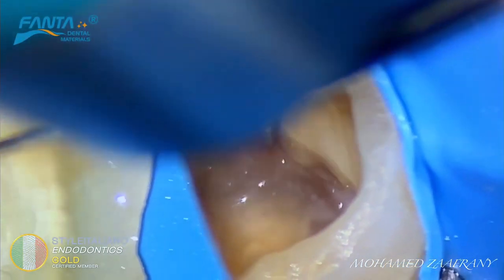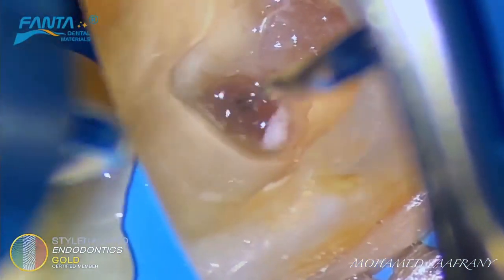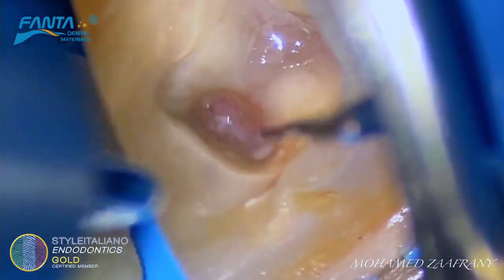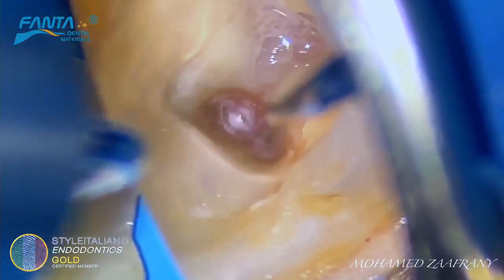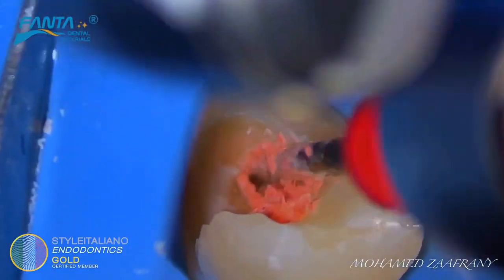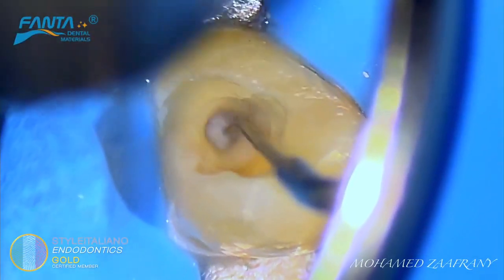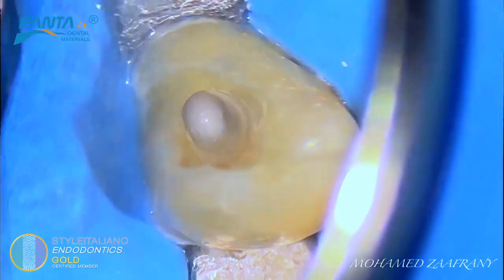The device is really effective in activating sodium hypochlorite, EDTA, and also in cleaning smear layers. In cases of retreatment, the actor iPro will help in removing remnants of filling material from inside the root canal system and also from inaccessible areas.